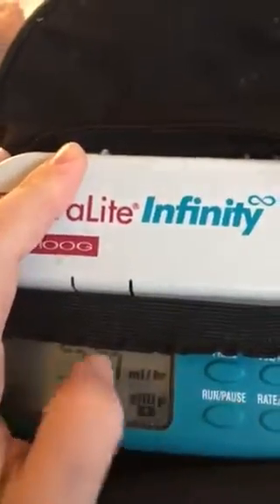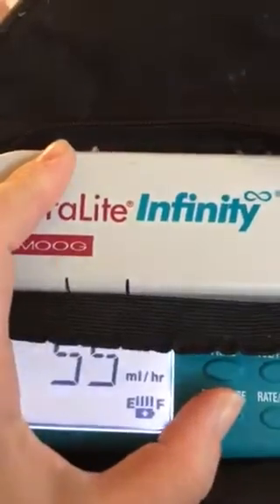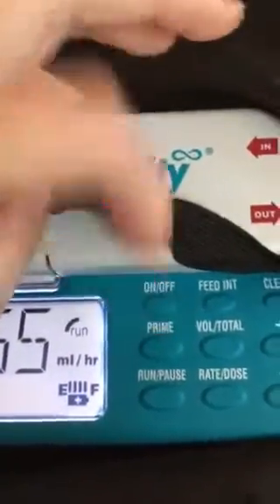Unclamp it and then come over here and push run. Don't forget — you push it once and it says pause, you need to actually make sure that you see it saying run. If you need to turn it on and off, here's the on and off button up here.